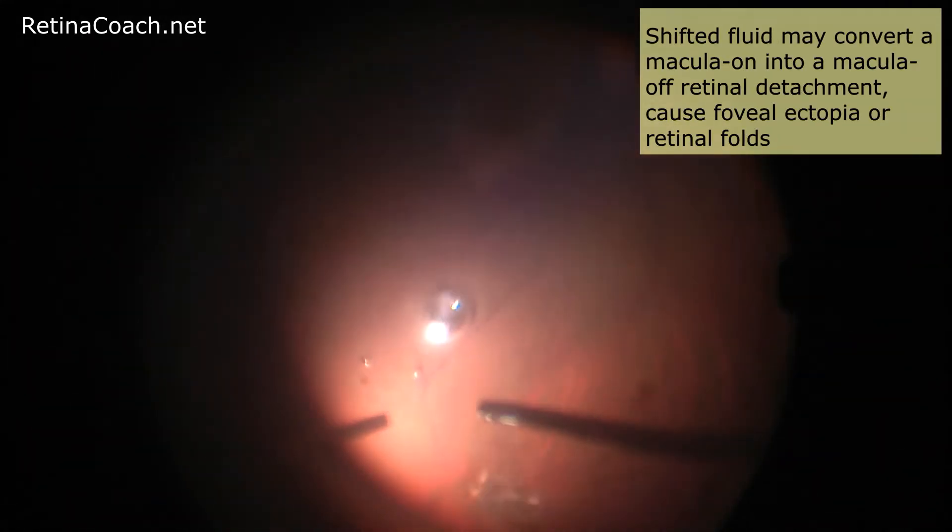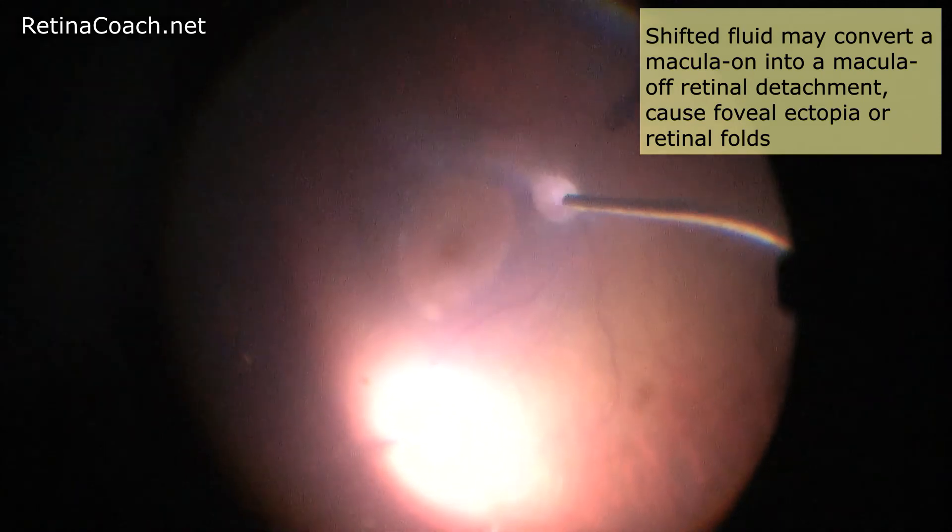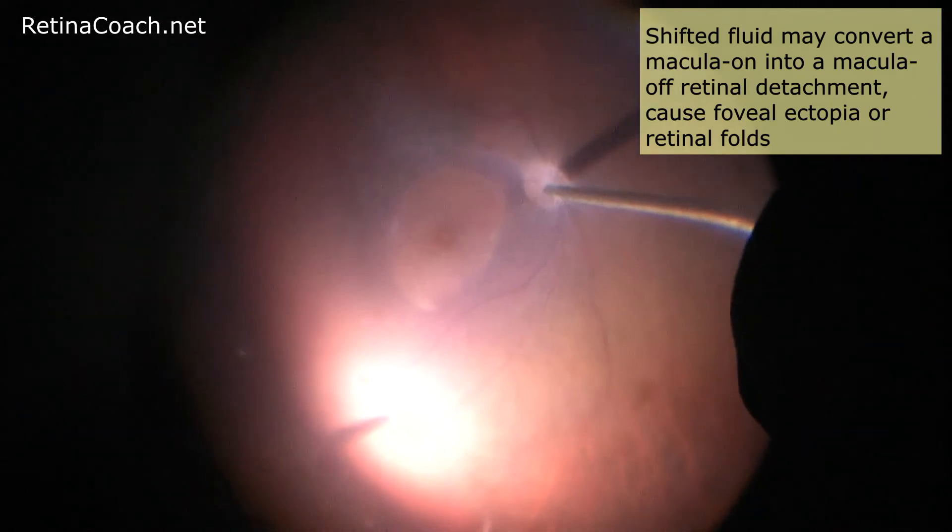As mentioned, fluid-air exchange without perfluorocarbon is quite a good choice for retinal re-attachment in case of small peripheral detachment. However, this technique is less suitable in the case of bullous retinal detachment. The reason is that when a large amount of fluid is present, the air pushes the subretinal fluid not only towards the break where it can be drained by a fluid needle, but also towards the posterior pole, where it may convert a macula-on into a macula-off retinal detachment, cause foveal ectopia, or retinal folds.